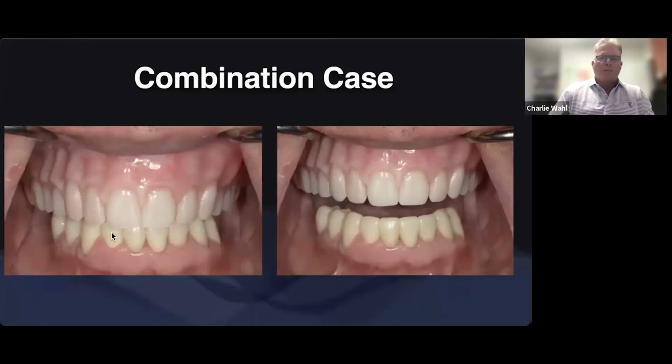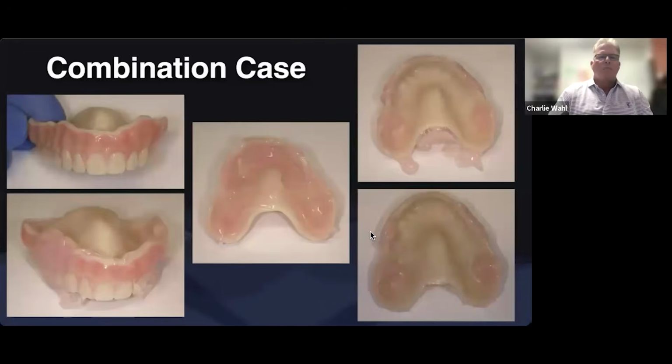Here's our immediate denture. Once again, it's our provisional. But you can see from our plan, we did pretty good, right? So we have a nice level lower occlusal plane. The upper's in a pretty good position. Aesthetically, looks pretty good. His upper midline is where it wants to be. We're at the mercy of where his tooth roots are, so his lower midline just isn't going to be there. But start to look at these tissues, right? Even pretty quickly, after a few days, that tissue's looking pretty healthy. And so just like all our immediate dentures, we get them through that process.